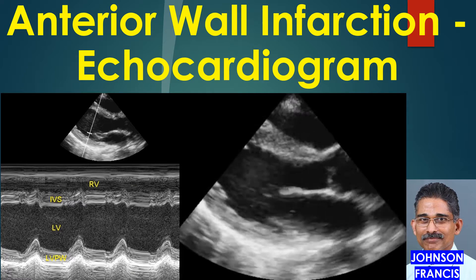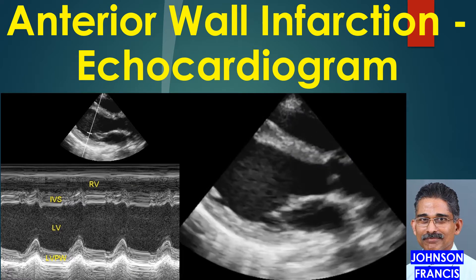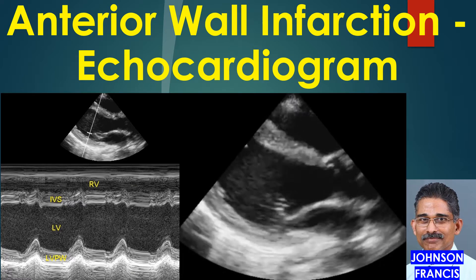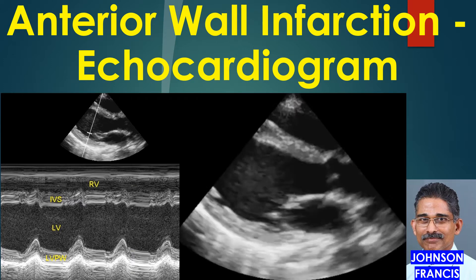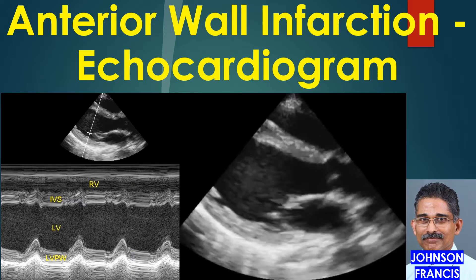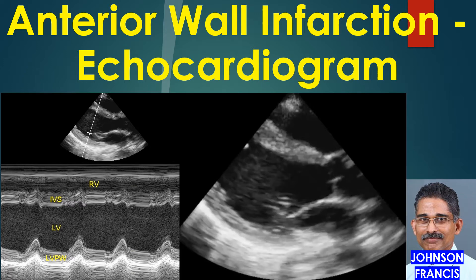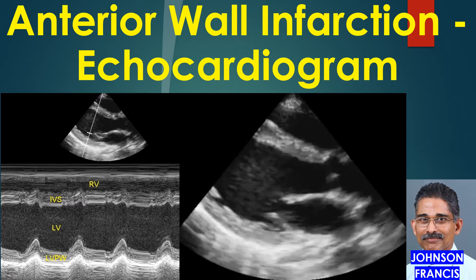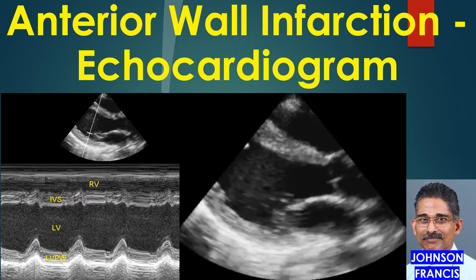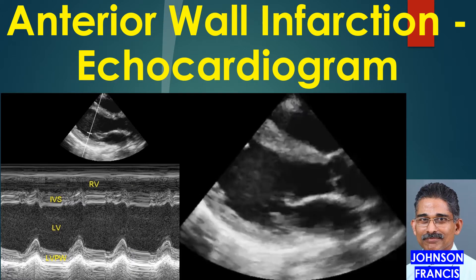Echocardiogram in anterior wall myocardial infarction. The left panel shows M-mode echocardiogram while the right panel shows two-dimensional echocardiogram in the parasternal long axis view, showing right and left ventricles, aorta, left atrium, and aortic and mitral valves.